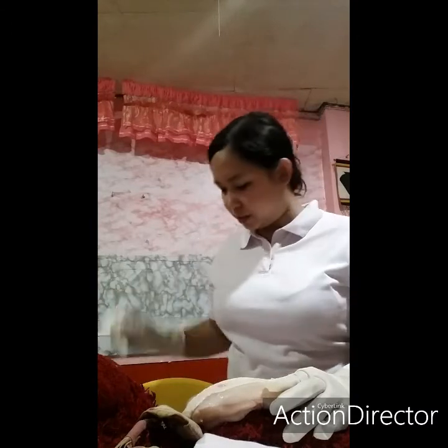Inject and don't hesitate. Then release. Remove the needle. Then put a dry cotton. Don't massage the area. Apply pressure but don't massage the area.